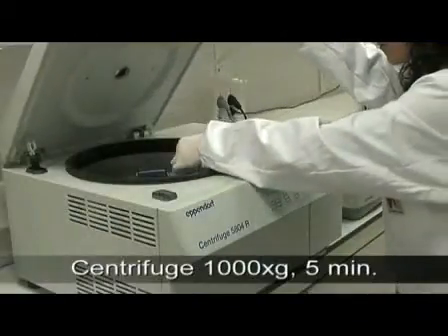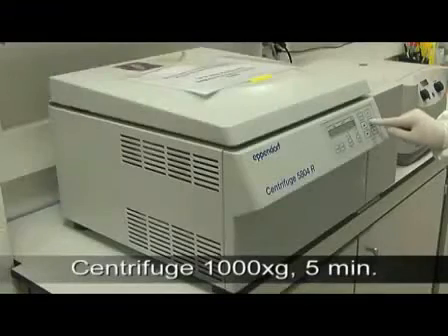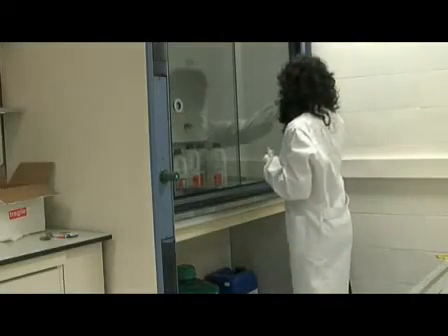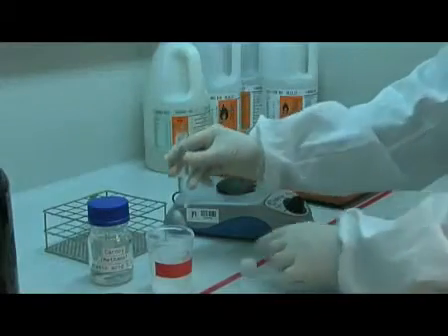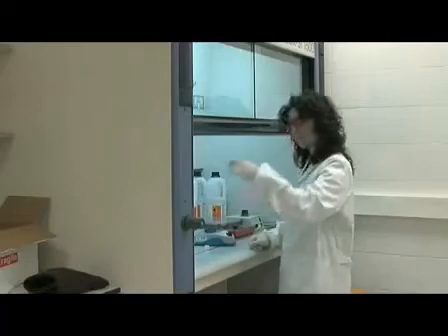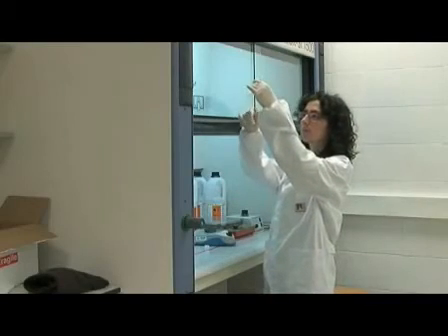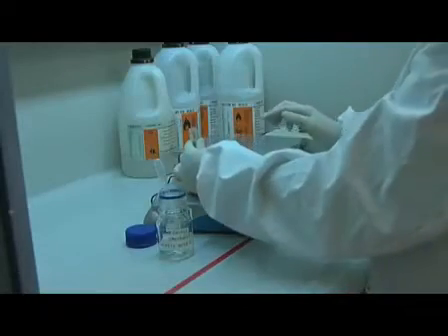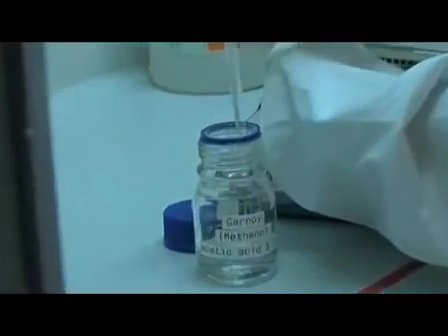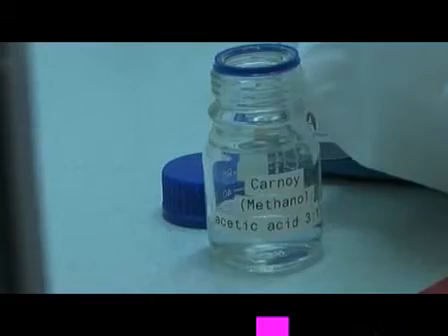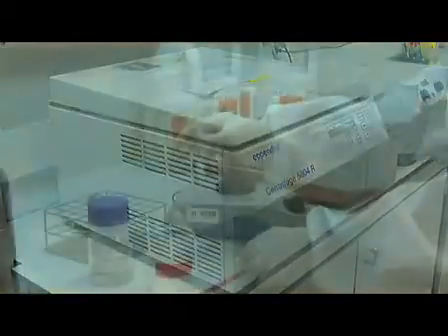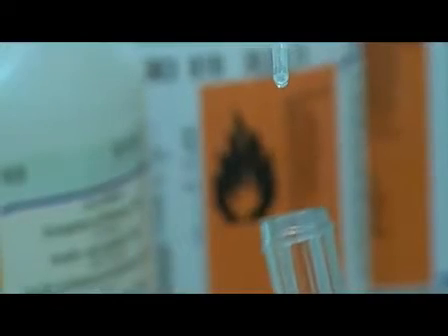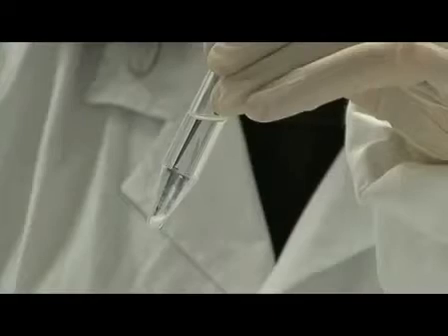And then the sample must be centrifuged again. Centrifugation causes the spermatozoa to collect at the bottom of the tube, allowing us to replace the hypertonic solution with the methanol acetic acid. Centrifugation must be repeated to change the methanol acetic acid as many times as is necessary to obtain a white pellet.